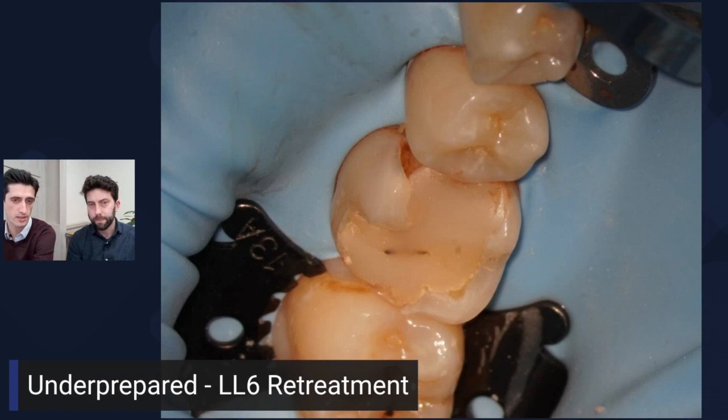This is the clinical picture with rubber dam already on, which is useful to look at from a clinical perspective. The initial question is: is this tooth worth keeping? With a young patient, I'm more inclined to say yes. Restoratively, the only way we'll know what we've got is to strip out the old dentistry, clean the caries, and see what's left — which is exactly what we did.